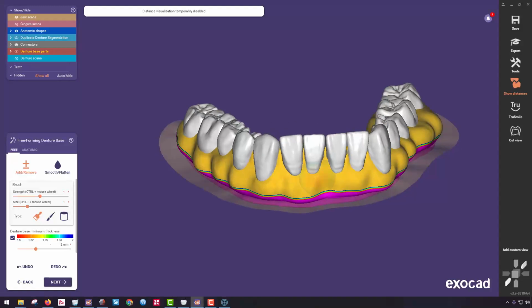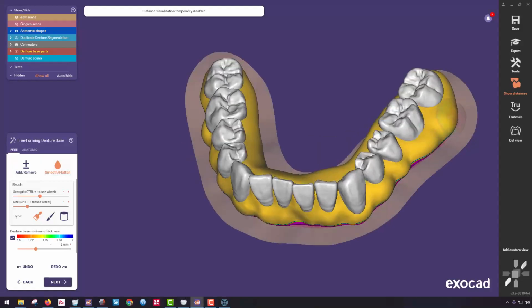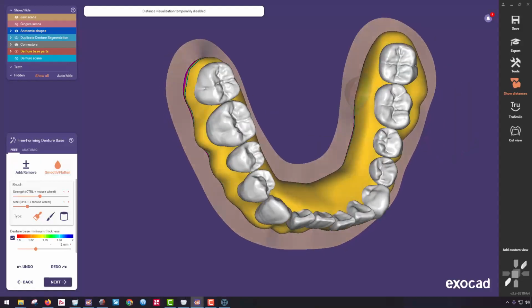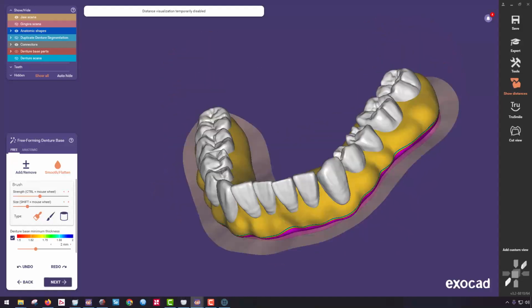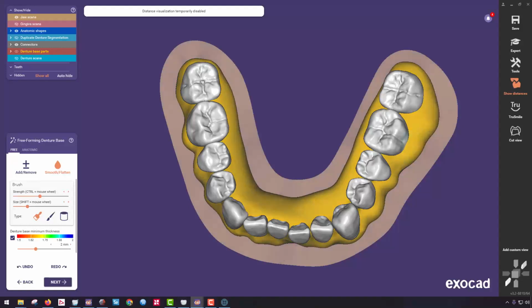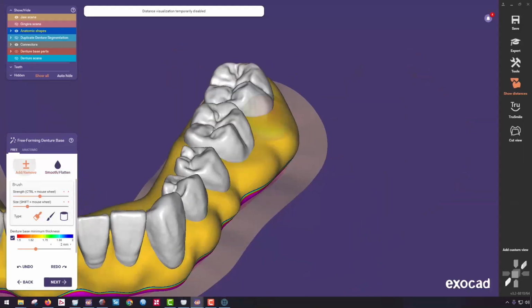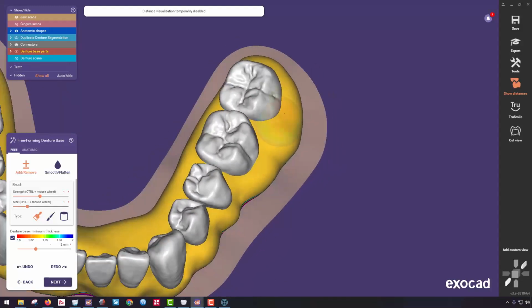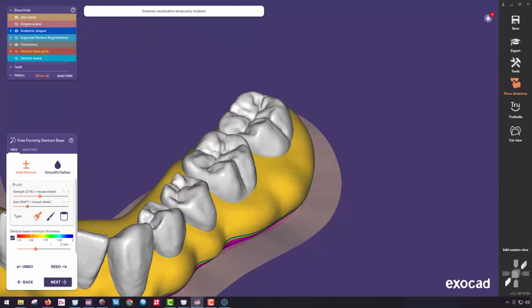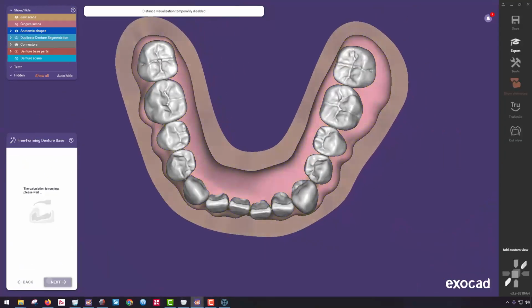But I can see here overall that looks pretty good. Thicken up my interproximals just a touch, and then smooth that out just a little bit back here. Smooth it out just a little bit, but overall that looks pretty good. I know it's sticking out a little bit, but my implant placement was a little bit buccal over in here. So y'all, I chose one of my realistic cases, not one of my perfect cases. So this is a realistic case of where the implant abutment is. All right, hit the next button.